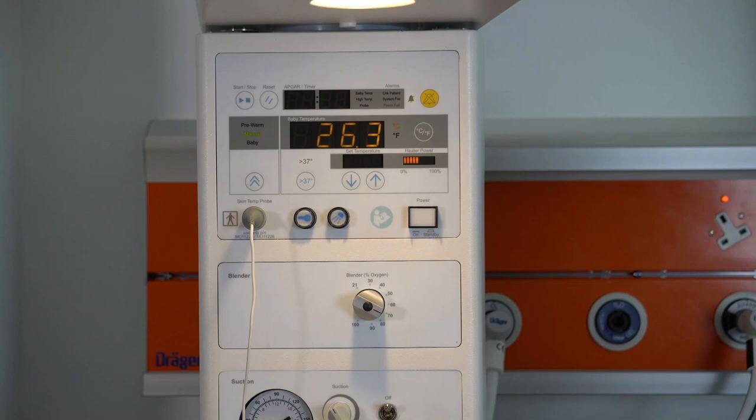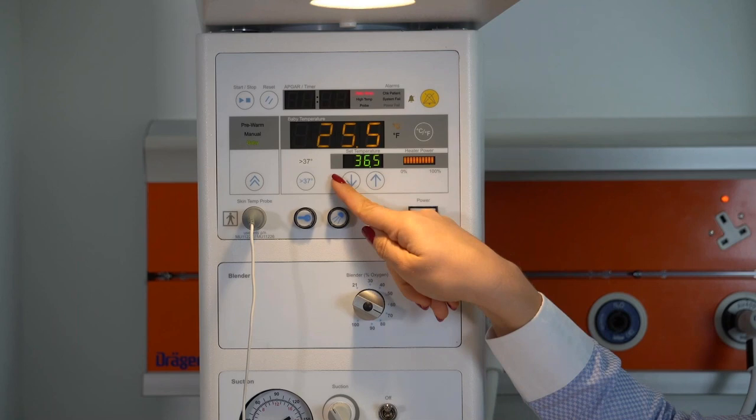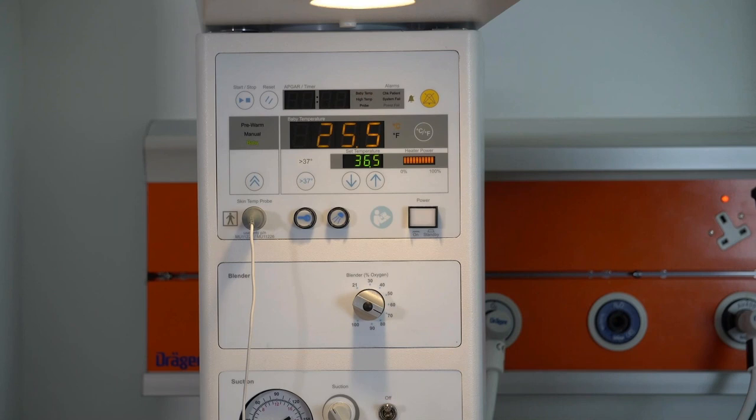And we also have a baby mode. So what does a baby mode mean? Let's switch now. The baby mode means that the device now automatically adjusts the heater output to reach the set temperature. And we actually advise to use all of your incubators and open care warmers in the baby mode. It's called baby mode, servo mode, servo control mode, skin mode, to make sure that we have synchronization with the baby temperature.